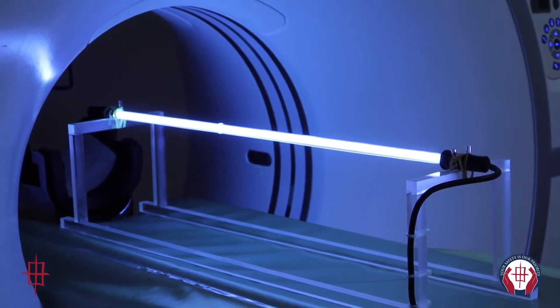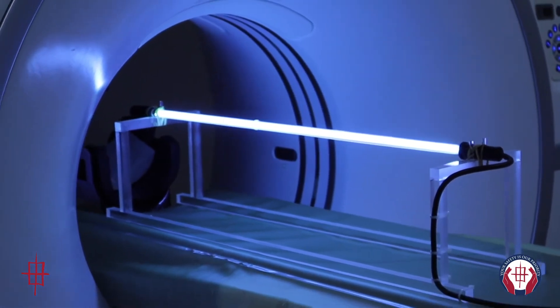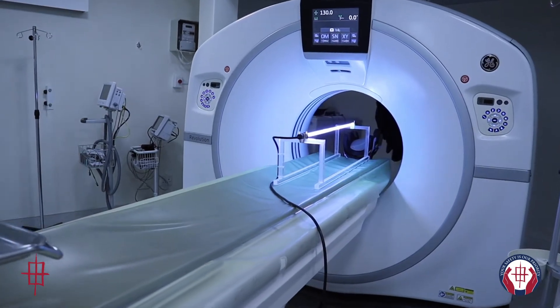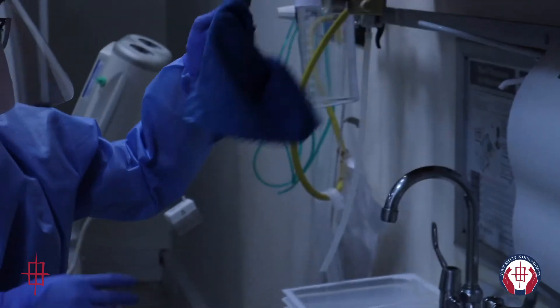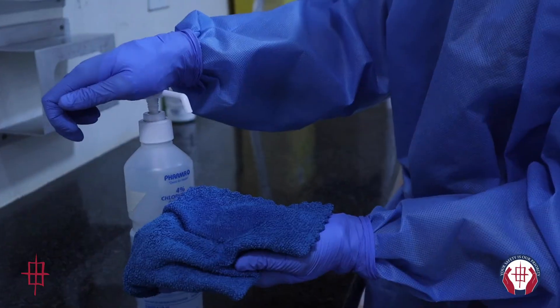Lexman & Partners has introduced mobile and MRI scanner compatible 55 watt UVC units in all our venues to aid in maintaining sterility of all imaging rooms and equipment.